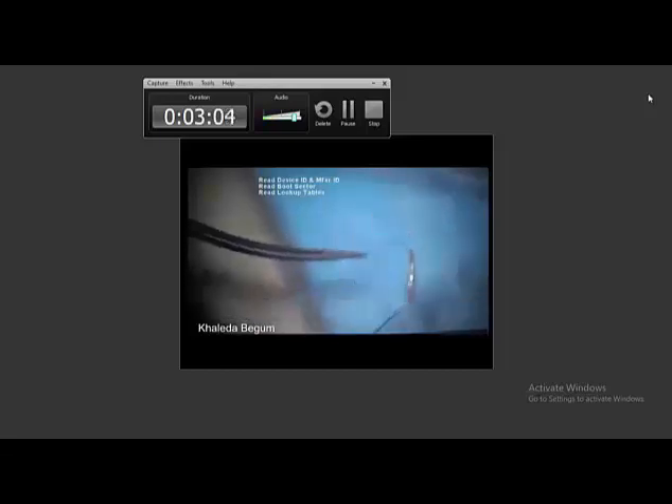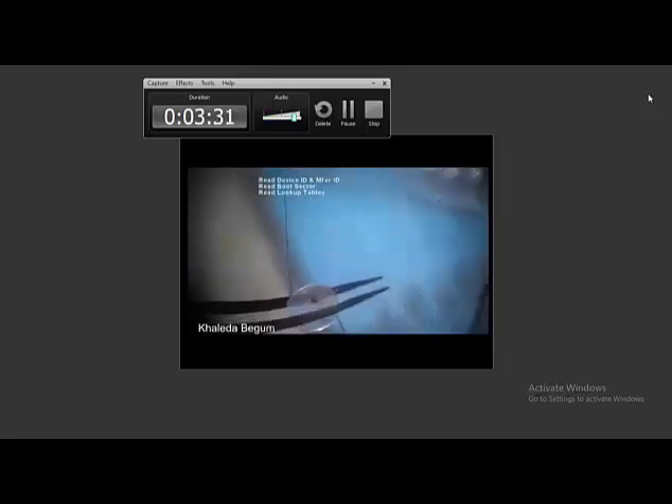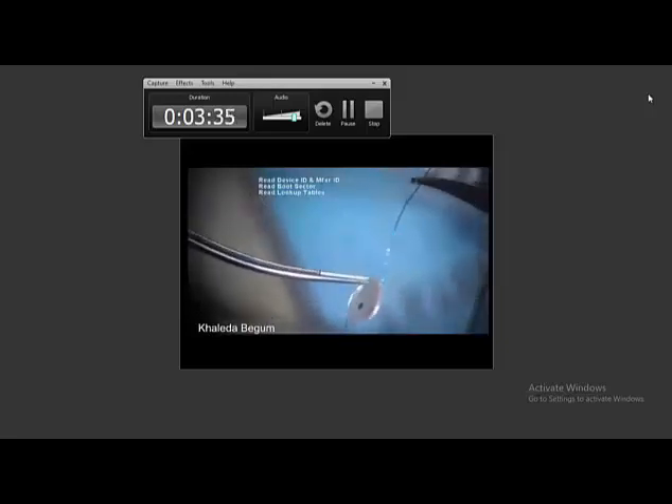Then I rotate the IOL — the dummy IOL — by holding where I have the prolene, to see whether the prolene is attached with the optic or not. The manipulation is not excessive. You can see there is the dummy IOL; the prolene is fixing well and firmly fixed with the optic.